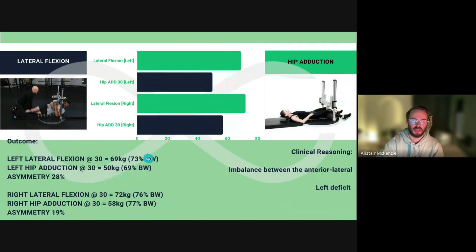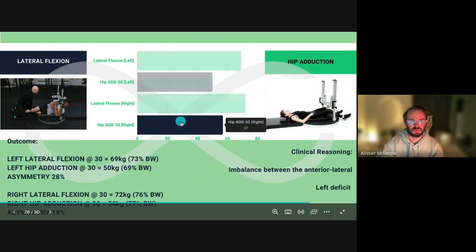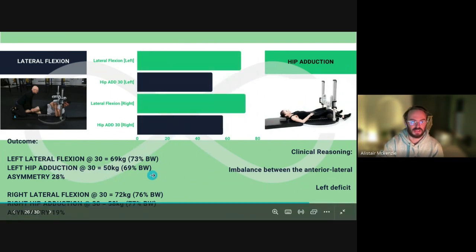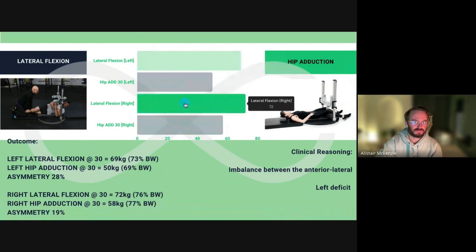What we can do then is look at the adductor aspect, and we can look at the link between the adductor. So if you're looking at this figure 8 and the person's lying down, and this is the front of their pelvis, their pubis, you've got the adductor coming into the pubis, into the internal oblique, into the lateral flexors, back round in this figure of 8 shape, right? So why not look at the adductor to lateral flexor ratio and consider the balance across there and what that'll do during stance phase. So the left flexors we've already got.